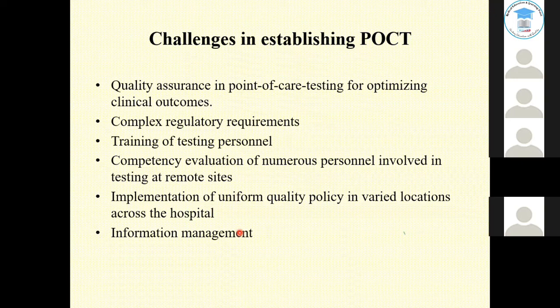So when we went about looking at the POC devices which were available, what we saw is around 88 to 90 glucometers, maybe 5 or 6 ABG instruments, ACTs, that is activated clotting time devices, and then thromboelastograms and bilirubinometers, all of them accounting for around 150 POC equipments, which nobody had any idea about. It was just being used by the nursing personnel across the hospital.